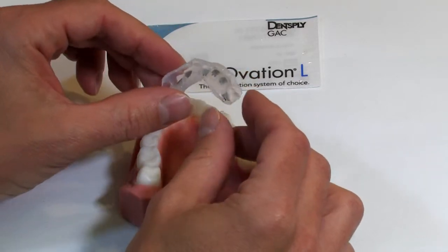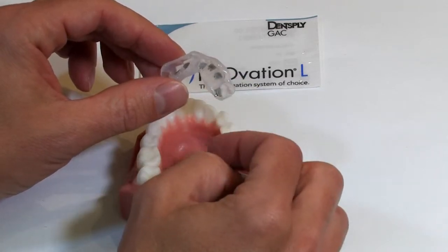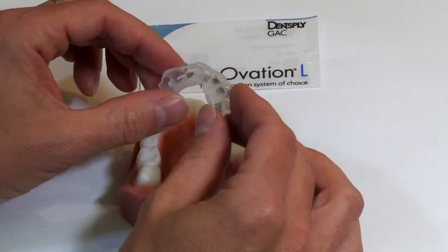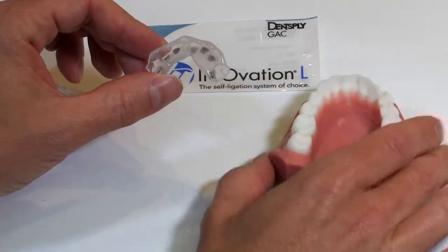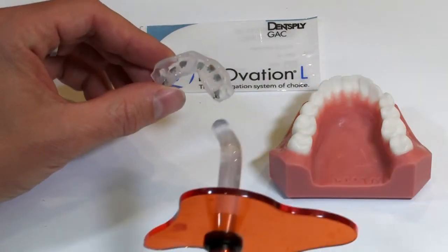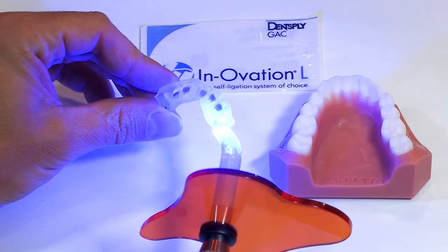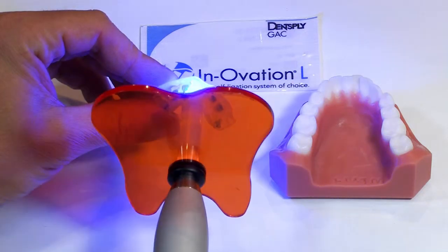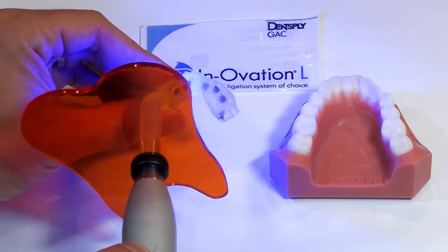With the stone model you need to be cognizant of the fact that only the surface layer — the surface ring of the composite — has been cured, because stone is totally opaque and unlike enamel you don't get full polymerization. So you have to go back in again with your light after you've done that separator and cure the composite just for a few seconds on each tooth again to make sure you're curing that complete custom pad.